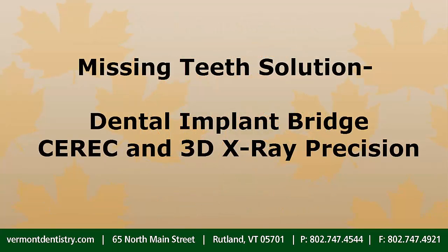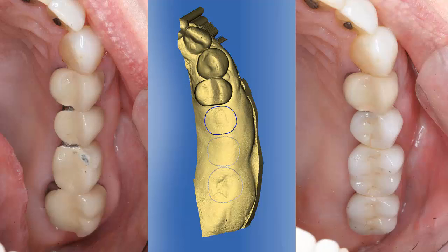In this video, Sirona's CEREC and Galileos 3D imaging helped restore a segment of missing teeth for a patient. Bone rebuilding and dental implant support for a new fixed bridge is highlighted.